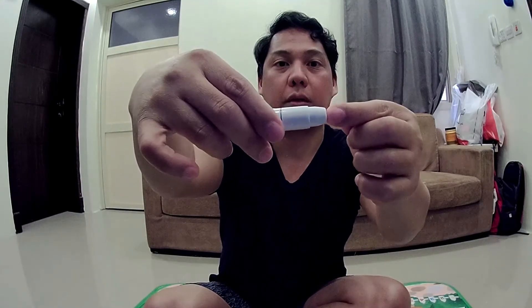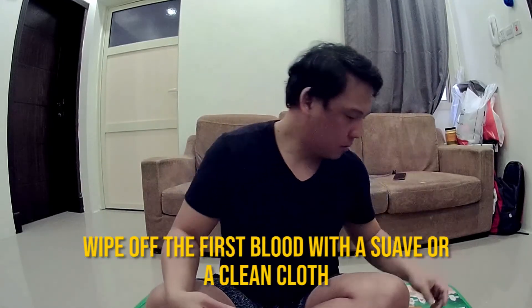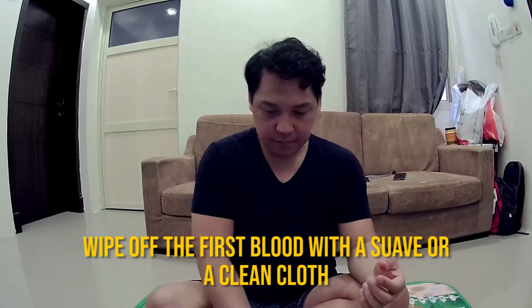I'm going to pull the lancing device to depth number three, pull it halfway until it clicks. Press just enough and prick the finger. Wipe off the first blood with a clean tissue and take enough blood for the sample — I think that's enough.